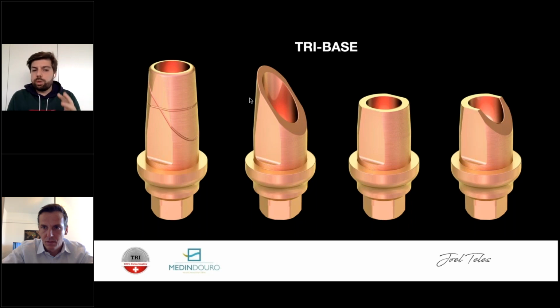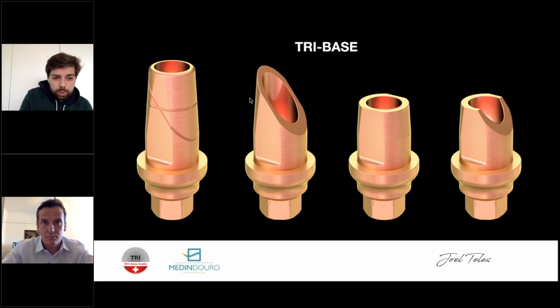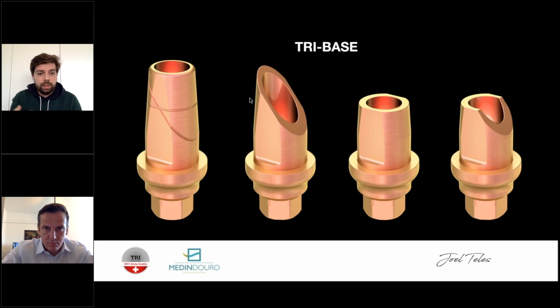First of all, the tie bases were poorly designed back in the days, and they were always the same height, and they didn't have any mechanical retentions on them, and therefore the labs were sandblasting them in order to then put the cement, thinking that this would add grip and the cement would work better. But he can show you perfectly that in fact this gets to a worse result. Therefore you get more decementations and more failures, because after the cementation normally it will break, or sometimes it will break.